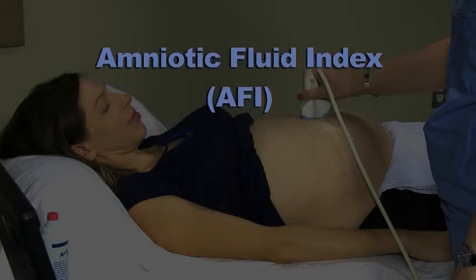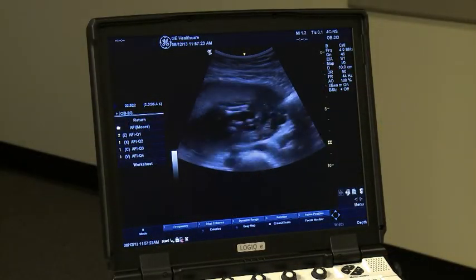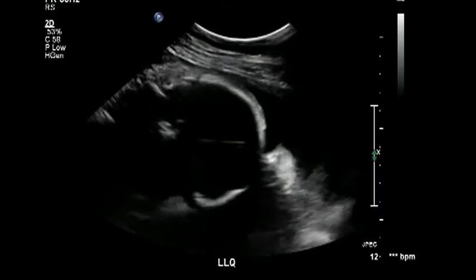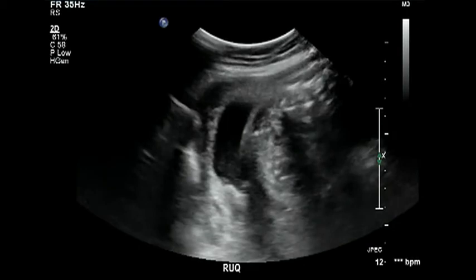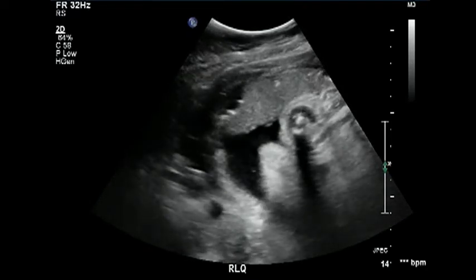If the AFI is too low, you may need to send the patient to the hospital for care. Here are the four components, or quadrants, of the AFI being measured: the first is the left upper quadrant or LUQ; next, the left lower quadrant or LLQ; third, the right upper quadrant or RUQ; and finally, the right lower quadrant or RLQ.